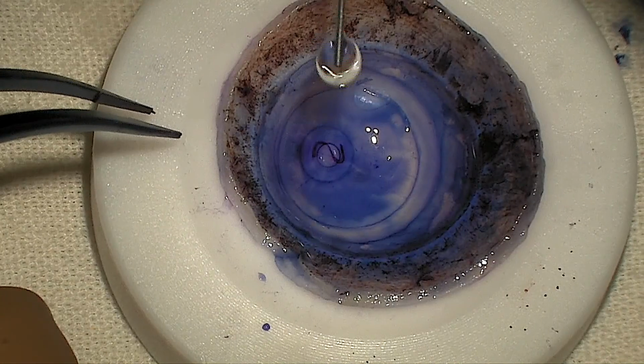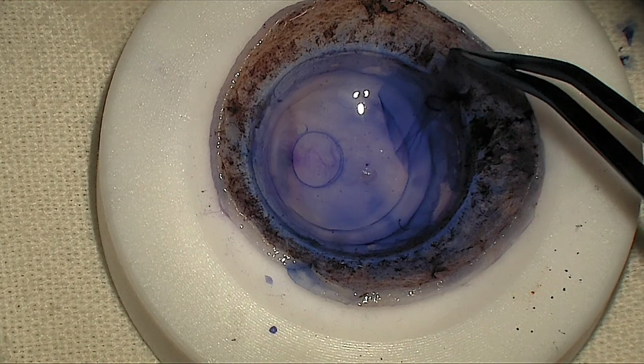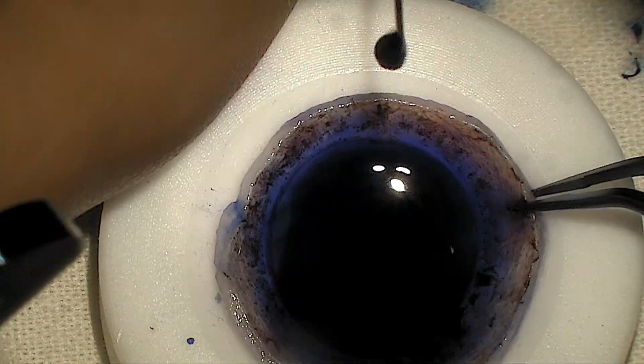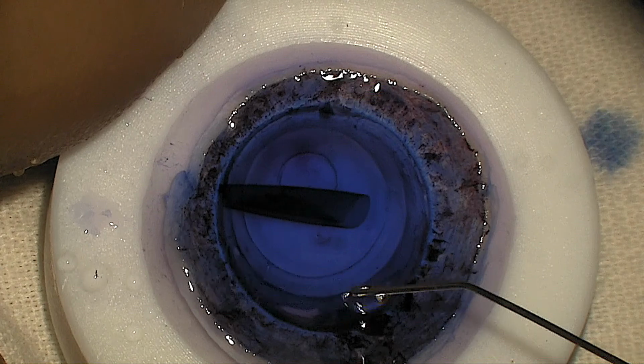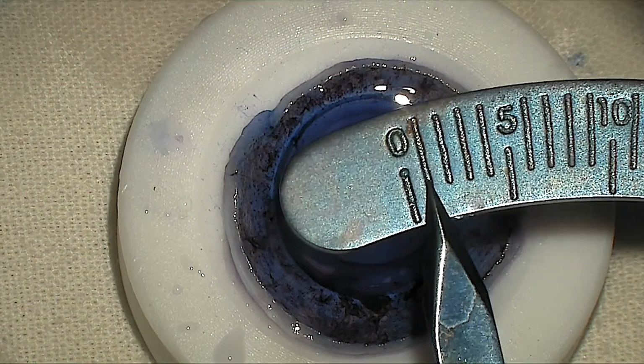The donor graft is then completely separated from the stroma with the help of McPherson's forceps. The final DMEK PD graft is stained with trypan blue dye for a minute, and then washed with balanced salt solution. This is transferred to a petri dish containing BSS and ready for loading into an injector system.